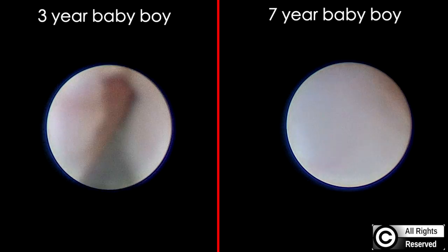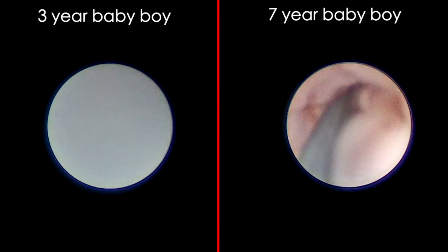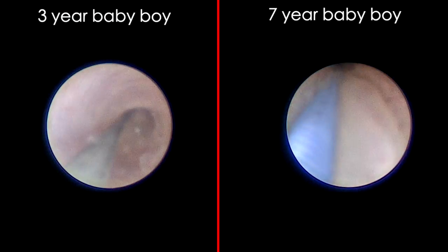Looking at both orifices: the seven-year-old's urethra on the right side has a larger lumen, whereas the three-year-old's on the left side has a smaller lumen. You can appreciate the difference in luminal size, comparing the less-than-five-years child with the more-than-five-years child.